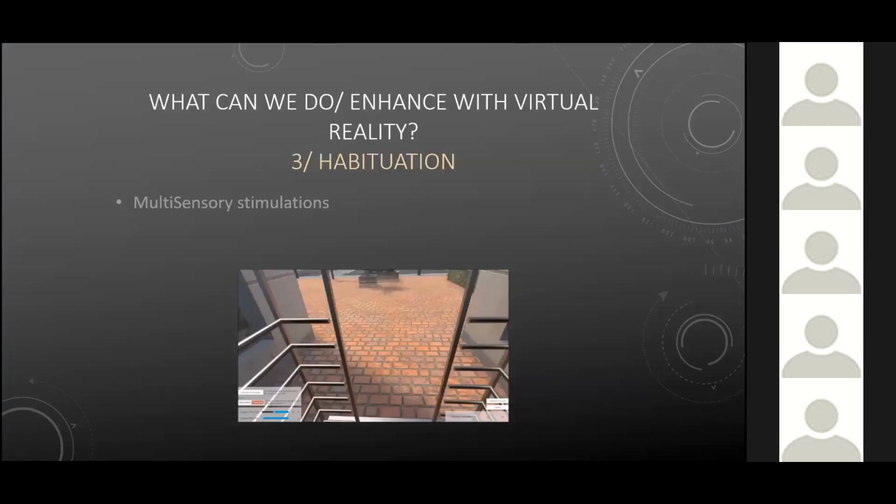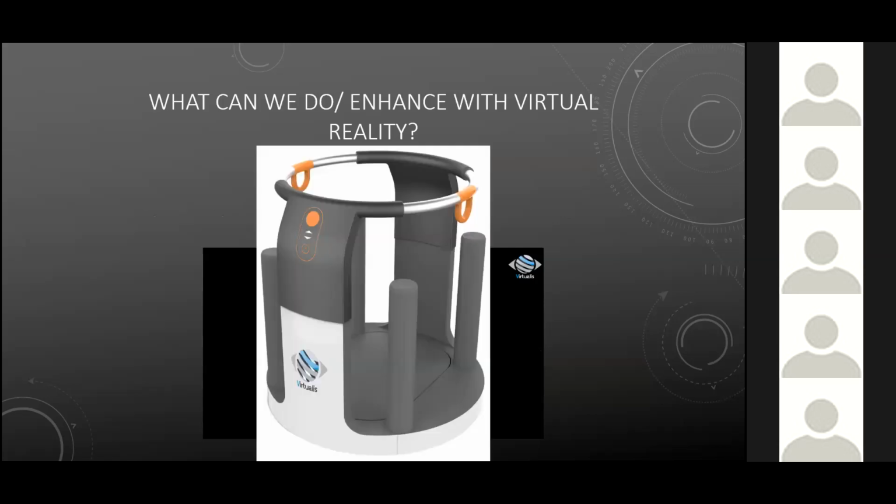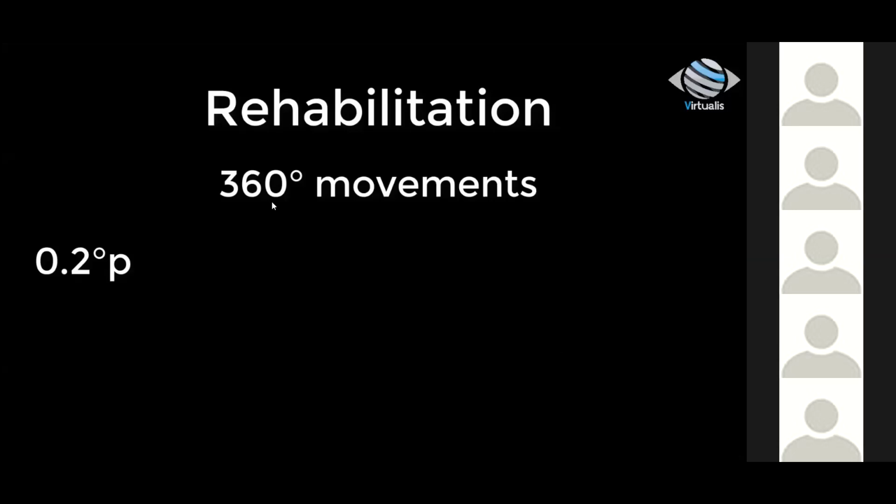Okay, and now we can even combine VR with computerized dynamic posturography, or a motion simulator with virtual reality. That's even more interesting because we will have all the movements as well. So that's what the actual CDP will look like. What I will show you now are old videos of prototypes, so maybe I will skip that.